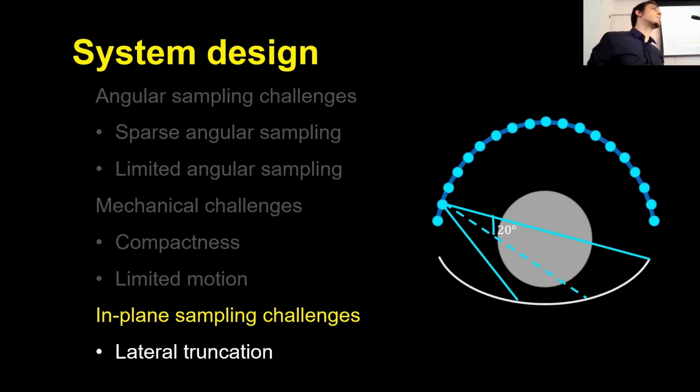But you can see in some cases the angle is very far from perpendicular. Does that lead to some negative effects? Have you thought about that? That's true. Thank you. That's also one of the things that using the curve detector is enhancing a lot.